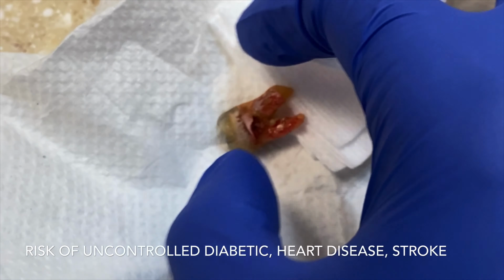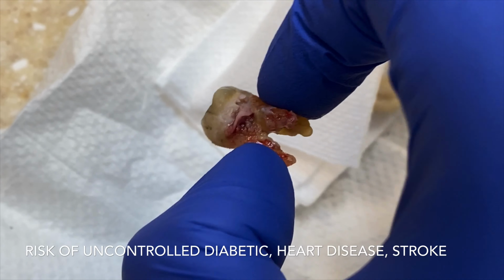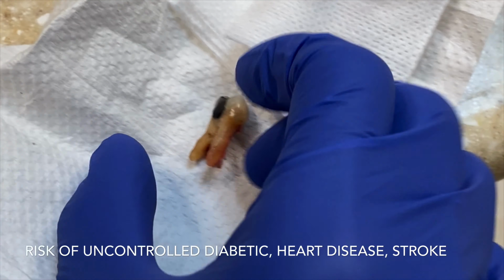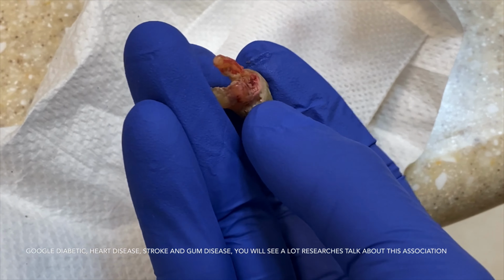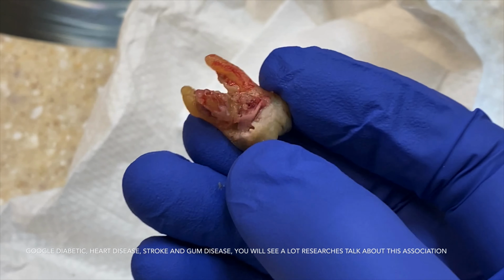And the same thing on number 16. Once we remove it, you can see how dirty it is. And this is how you convince the patient with a video like this. Show them that even though it doesn't hurt, it doesn't mean that she's okay. Really bad infection. Okay, you show the patient this video.